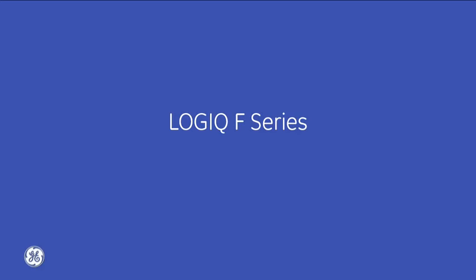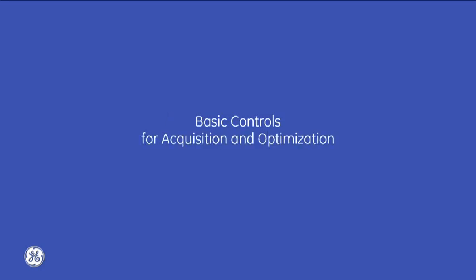Welcome to the Logic F-Series with touch panel elastography instructional video. I will now go over the elastography capabilities of the Logic F-Series system, including the basic controls for acquisition and optimization.